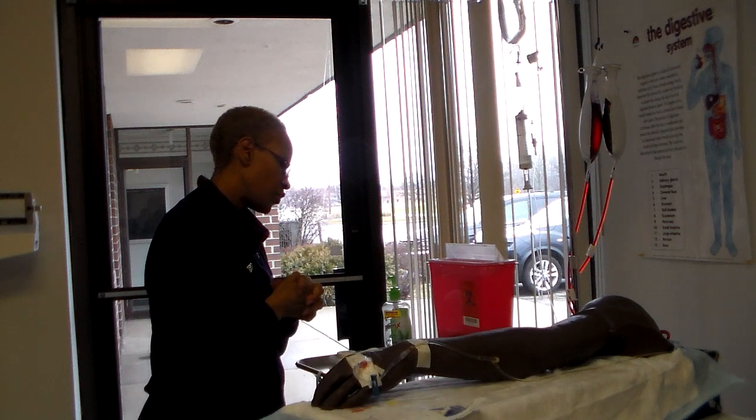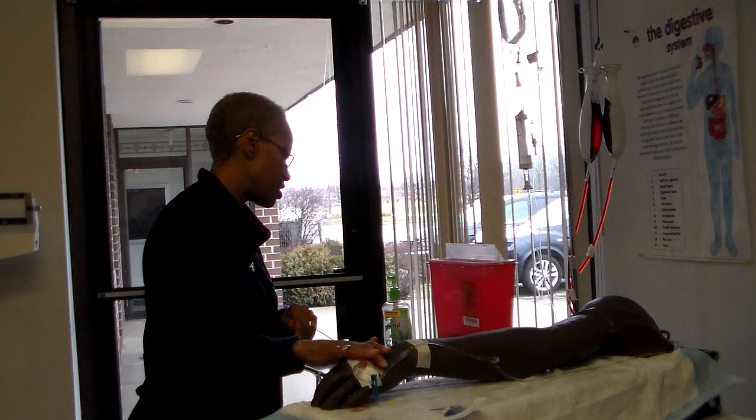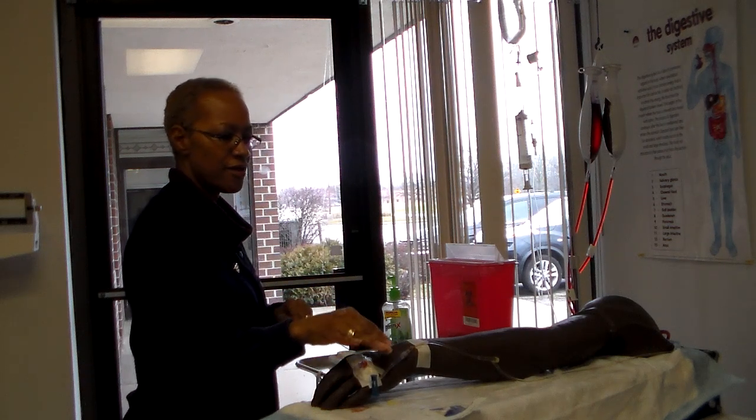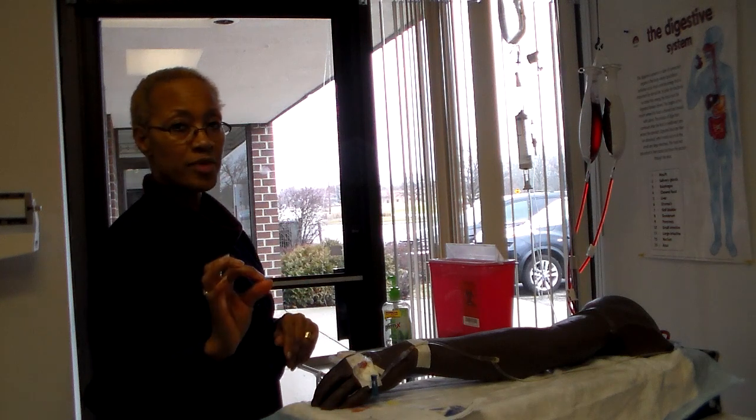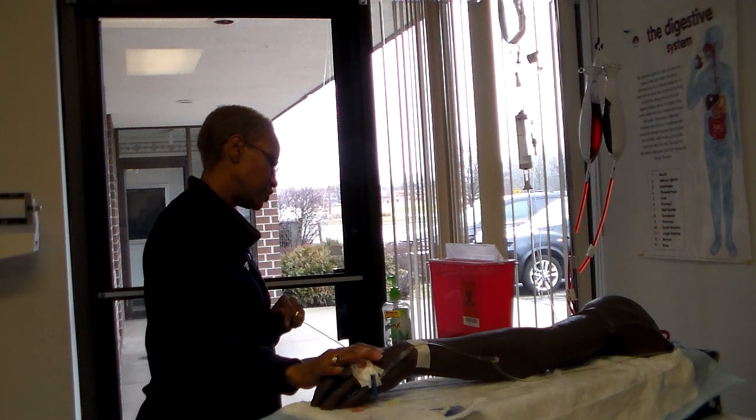She states no. And then every 72 hours, we're going to come back and change this peripheral access, where you're actually changing the IV. If it gets wet or something, you may change the dressing, but you're going to actually change the IV every 72 hours.